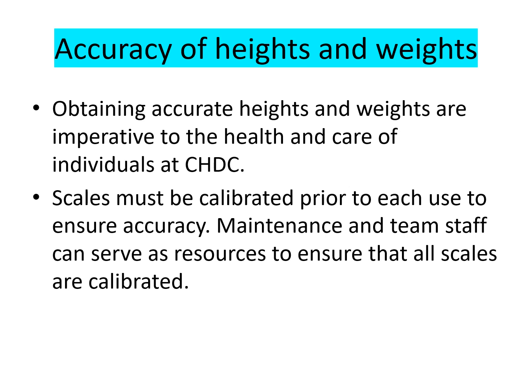Accuracy of heights and weights. Obtaining accurate heights and weights is imperative to the health and care of individuals at CHDC. Scales must be calibrated prior to each use to ensure accuracy. Maintenance and team staff can serve as resources to ensure that all scales are calibrated.